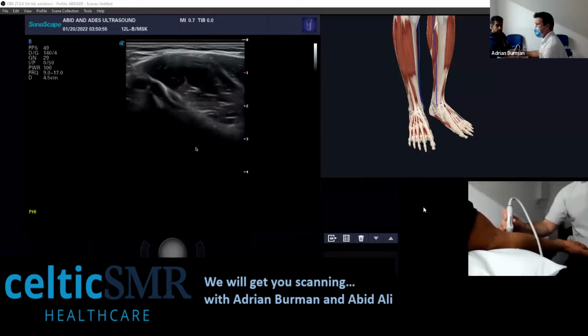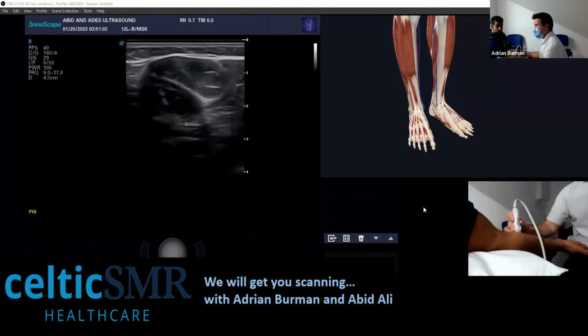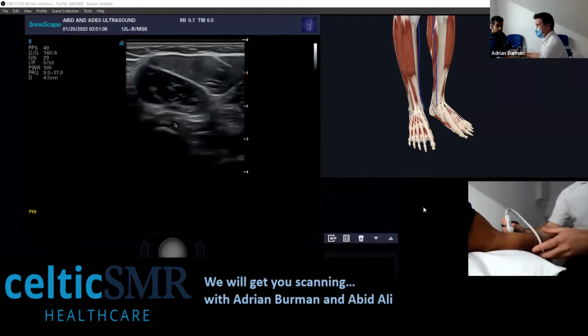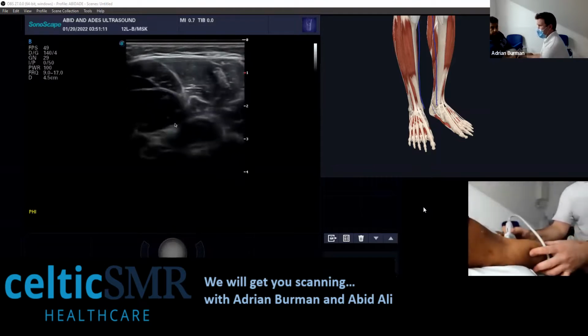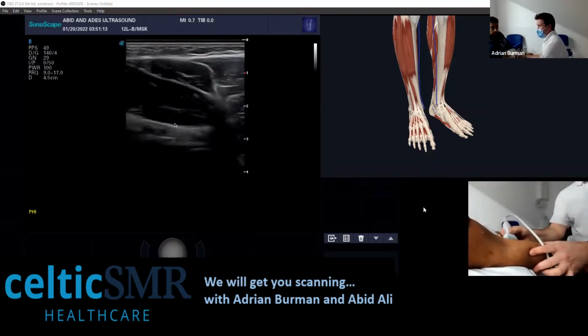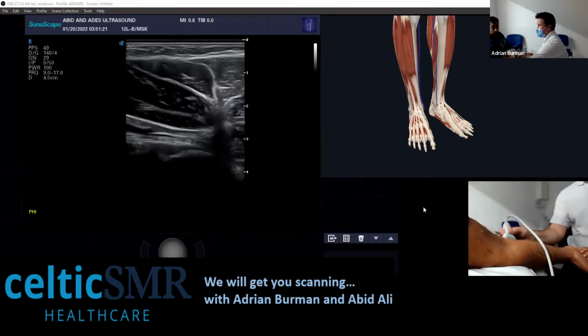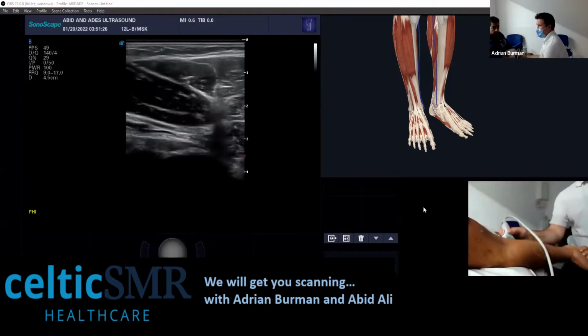So this is the median nerve. Down to the bottom, and then this is the radial tuberosity. So I go around into the medial aspect and then angle back up. This is down here. So then I write onto the depth and take the focus down. All that helps. Looking on that inserting nicely there.